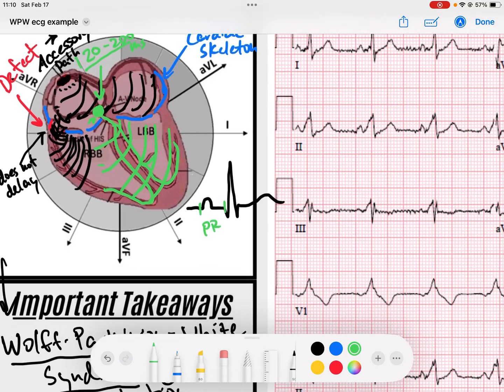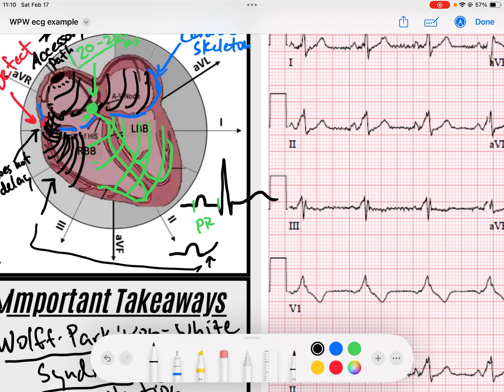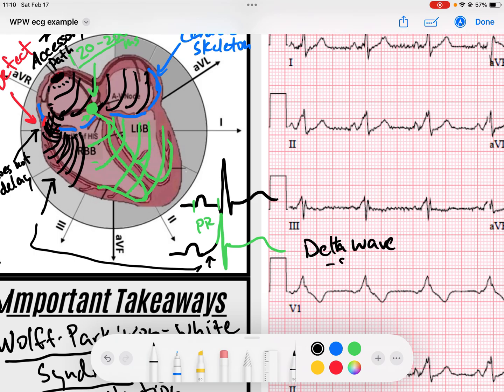How is this represented on the ECG? We have our P wave representing atrial depolarization, but instead of a flat PR interval, you start to see a slurring upstroke. That slurring upstroke represents slow depolarization of the ventricles via the accessory pathway. Then, once the AV node passes the signal down, we get the sharp deflection of our QRS and the T wave that follows. That slurred region is called the delta wave.